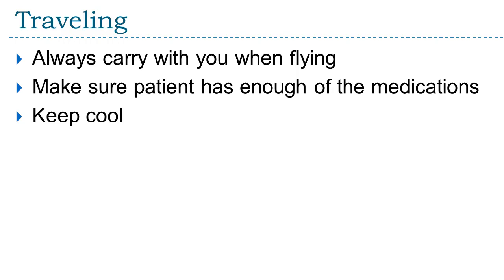When these are working great, it's wonderful for our patients, okay, because they don't have to give that repeated injections to themselves. And really, it can monitor blood glucose levels, so you're not checking an AccuCheck all the time like you would, or the way we do when we're in the hospital with our patients.